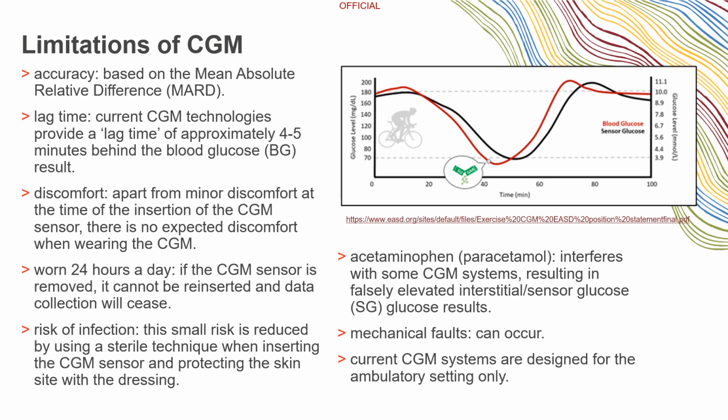There is discomfort, but it is minor at the time of the insertion of the CGM sensor. However, there is no expected discomfort when wearing the CGM from there. The CGM sensor is worn 24 hours a day and it cannot be removed. If it is removed, it can't be reinserted. Data collection is ceased and a new sensor is required for data to recommence.